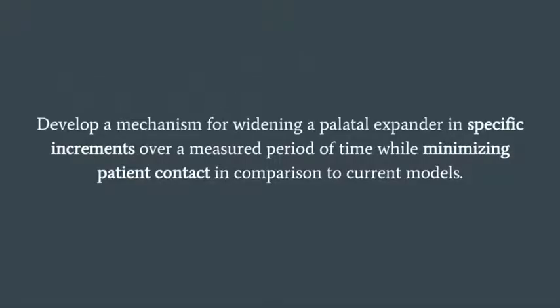So with this, we developed a problem statement: to develop a mechanism for widening a palatal expander in specific increments over a measured period of time while minimizing patient contact in comparison to current models. With this, we mean specific increments, as in the orthodontist can know exactly how much the palate is expanding by, and then minimizing patient contact.